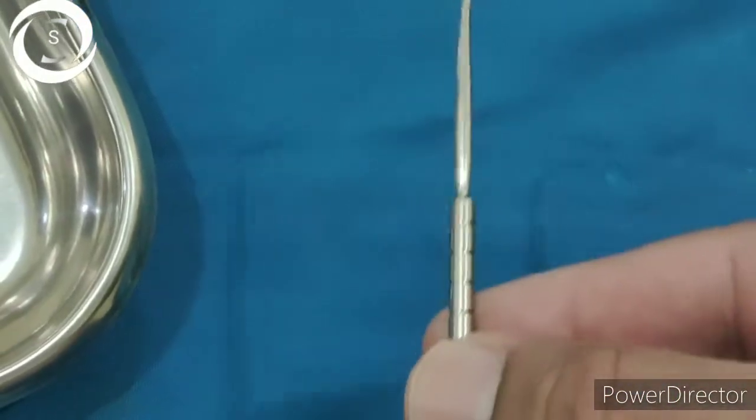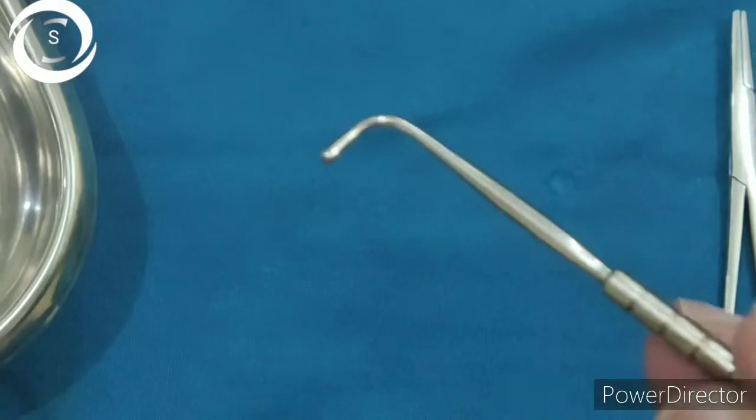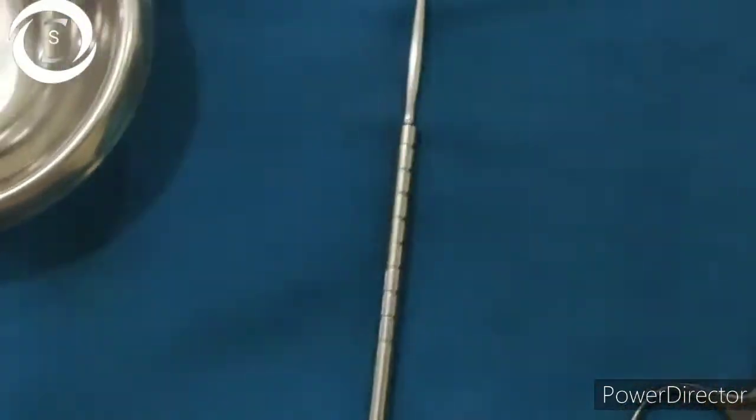This is the Graefe muscle hook, or squint hook. It is used in squint surgery to identify and secure the muscle, and in cataract surgery to deliver the nucleus by putting positive pressure on the cornea.